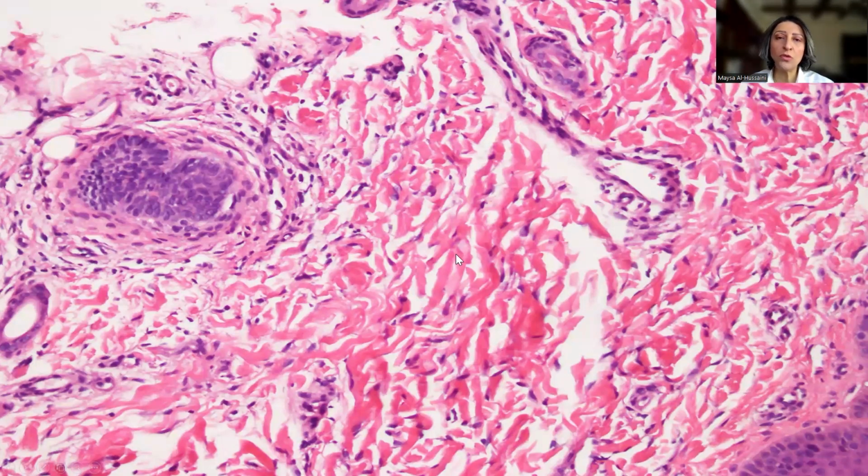So the message from today's tip is two-fold. Number one, there is an entity called BCG-osis related to dissemination of acid-fast bacilli following a vaccination, and it has certain criteria. I have in the caption a beautiful article that summarizes the findings of BCG-osis.